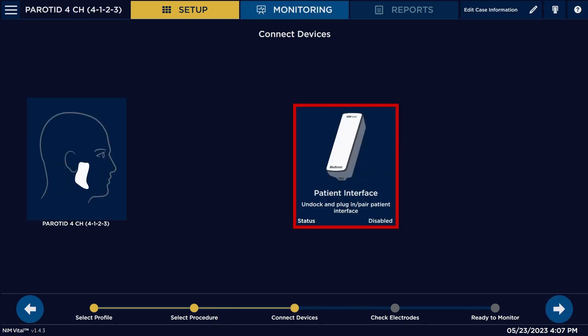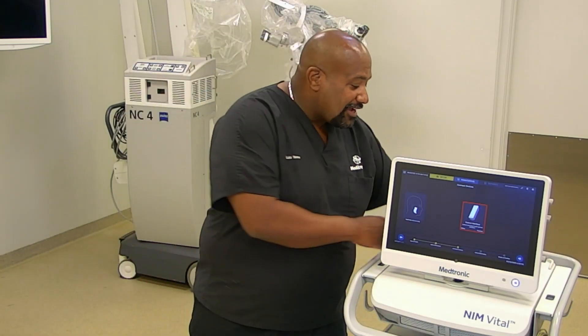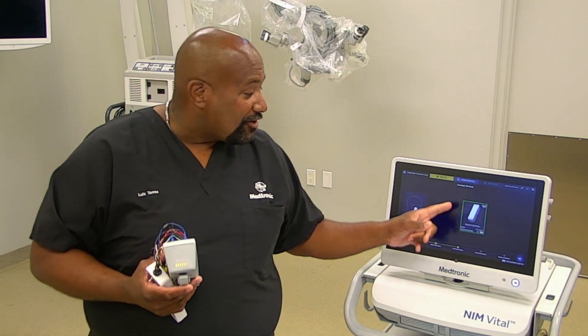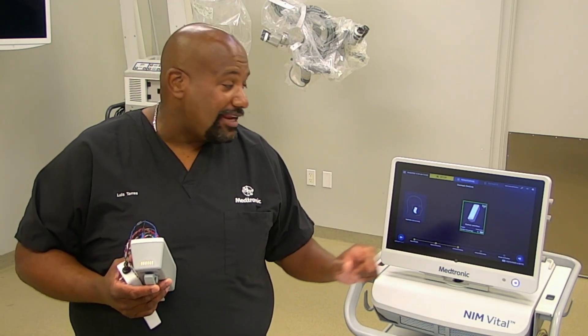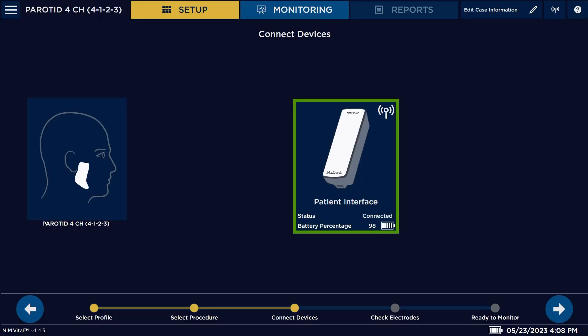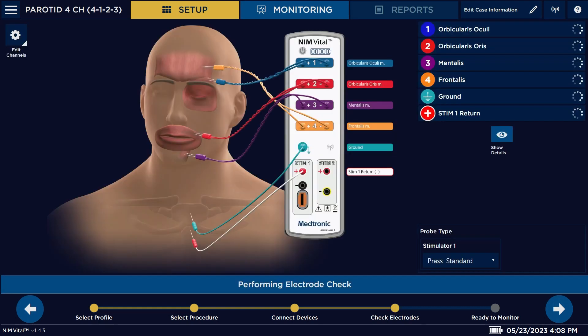So if you select that, we're going to come up to this screen here, which is going to want you to undock your patient interface. We're going to notice the little square here that was red — now it's green, letting us know that it has read our patient interface. This is all wireless, which is why it was doing this little sync process. Once it's done and it's green, you hit your arrow to go to your next part.